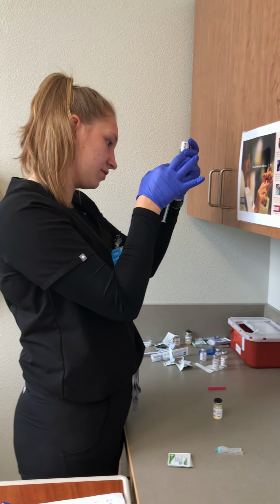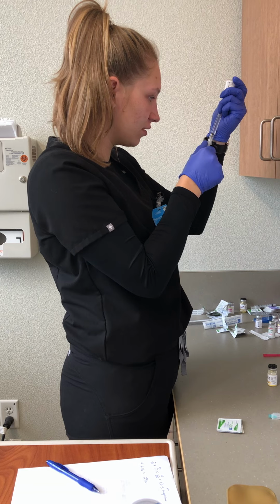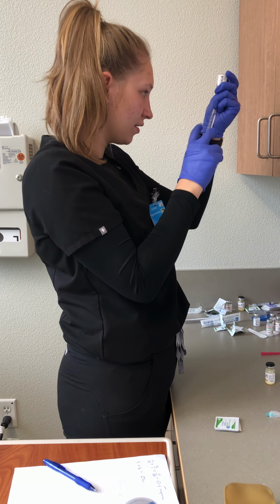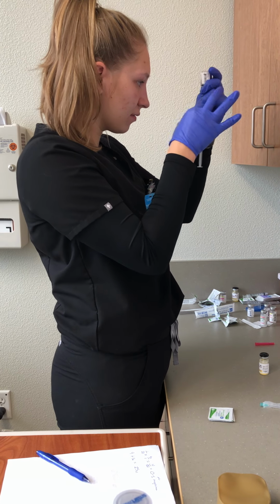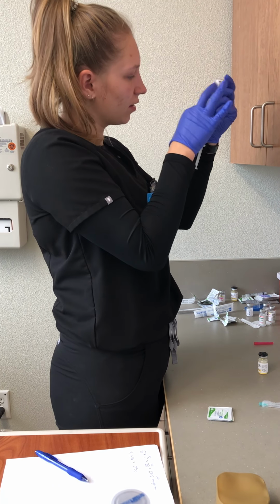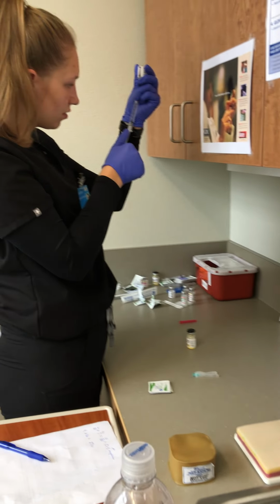Move this bubble up to the top. Okay, I'm going to pull back past there, so then that way I can work on getting this last bubble out.